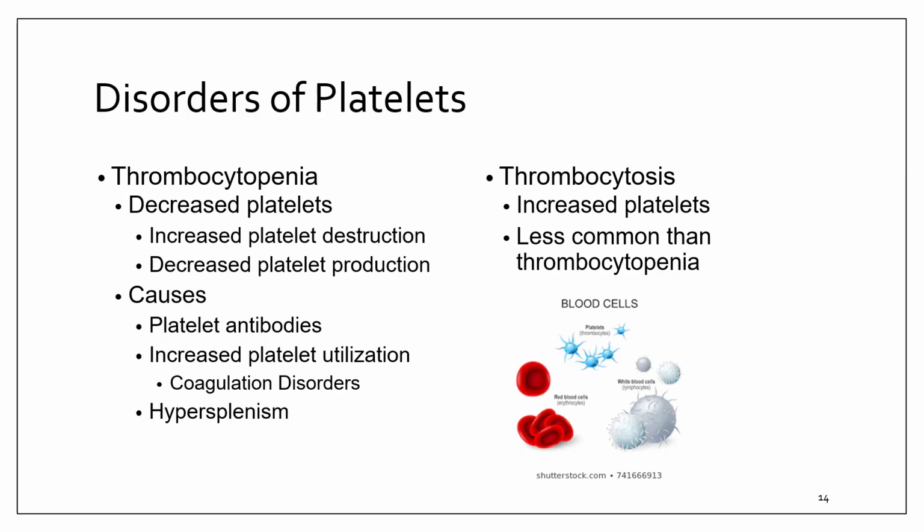In peripheral smear, you may see very few platelets, sometimes large or giant platelets. This is the marrow trying to compensate. Otherwise, fairly normal red blood cells and white blood cells. Remember, platelets are cytoplasmic fragments of megakaryocytes, so when production ramps up quickly, they're often oversized.